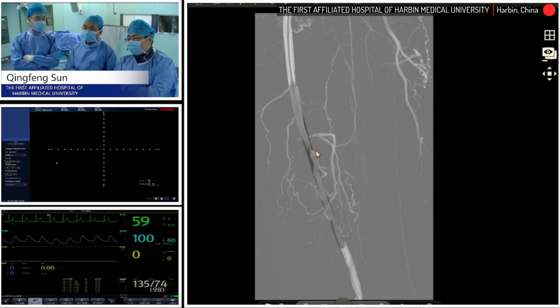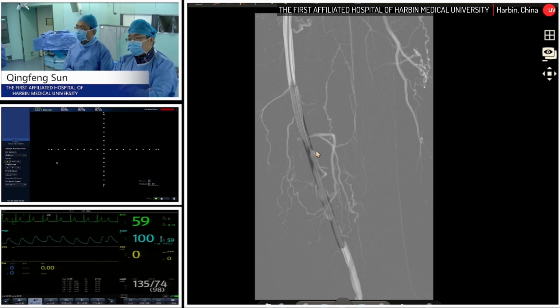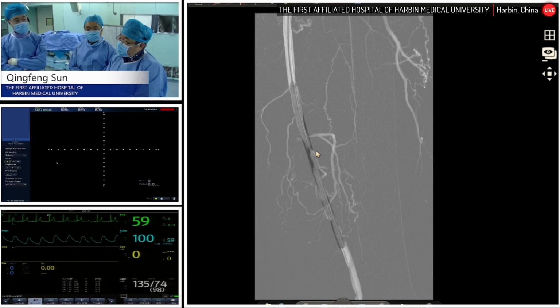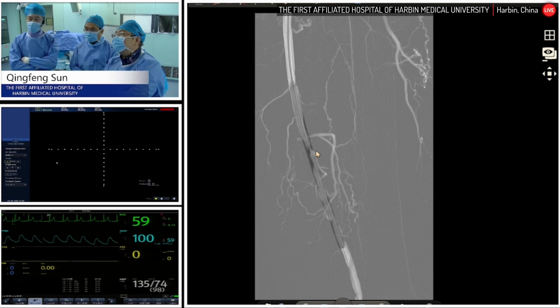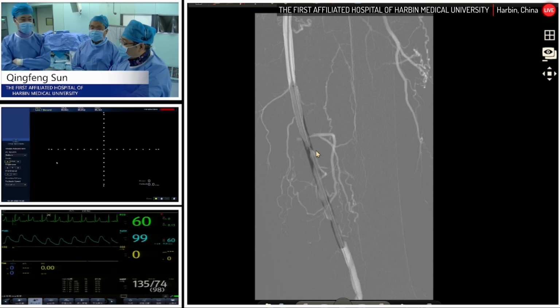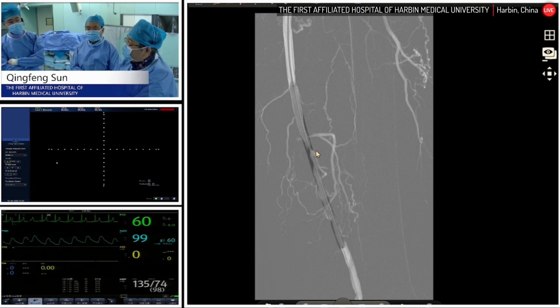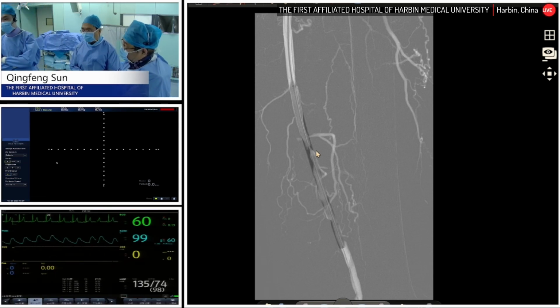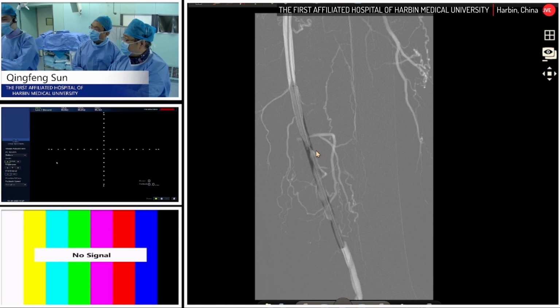So this one also goes 2 minutes? 3 minutes. Oh, okay, 3 minutes. After that, we're using IVUS again, right? For debulking, maybe like DCA or PMT. It's good for vessel preparation, but in China, it's maybe expensive. I know, I feel you. So yeah, definitely.